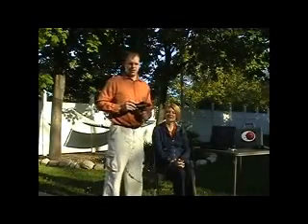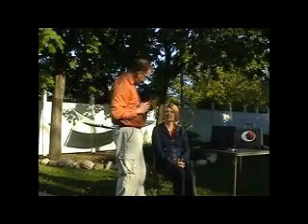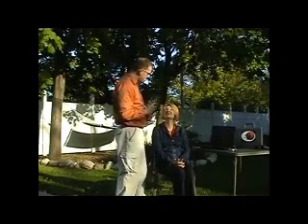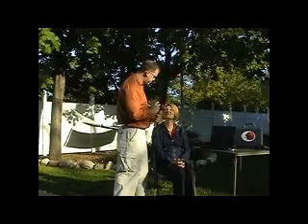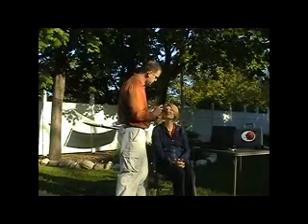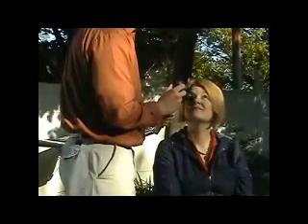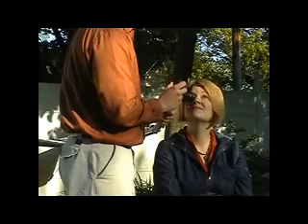You can use the ProVision camera attachment to view mid-peripheral retina by having the patient look in an extreme gaze and manipulating the system in order to see into that red reflex. I am going to have the patient look straight up high as far as she can, and I am going to follow that red reflex keeping the Panoptic in the minus. I can tip down like this and get a good mid-peripheral view.